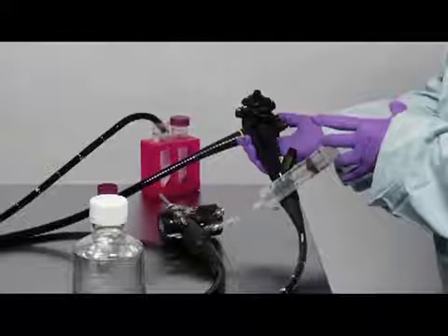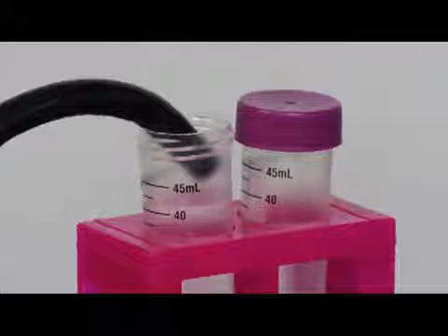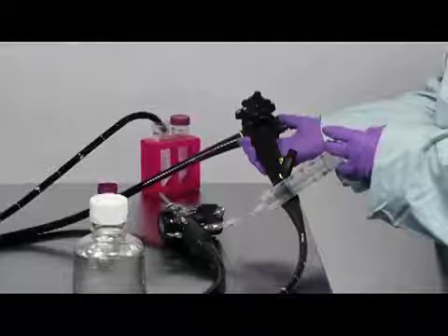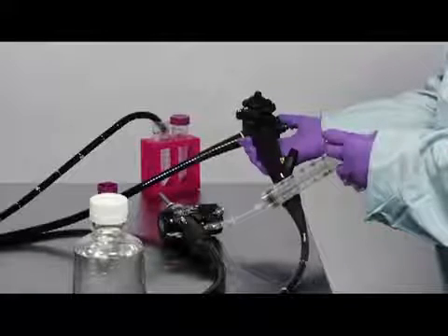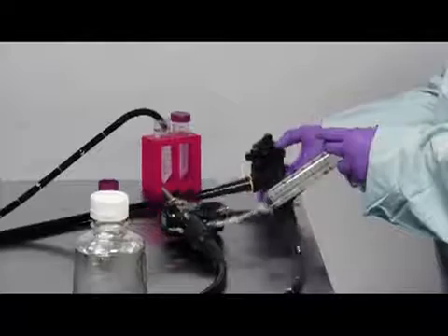And we got 40 mils, and as you can see, the distal end is hooked so that that distal end does not dip into your sample. That's really important. Once you're done with that, let go of the valve, and that completes your sample collection.